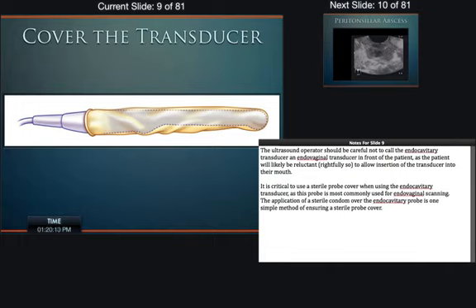But the patients, once they find out what it's used for, I had a very funny case about 2 years ago where this young kid, what I do is I hand the probe to the patient. I have them insert it in their mouth, and then they can rest their teeth gently on the probe. And the guy's sister, who was like 8 years older than him, looks at him and looks at the situation.